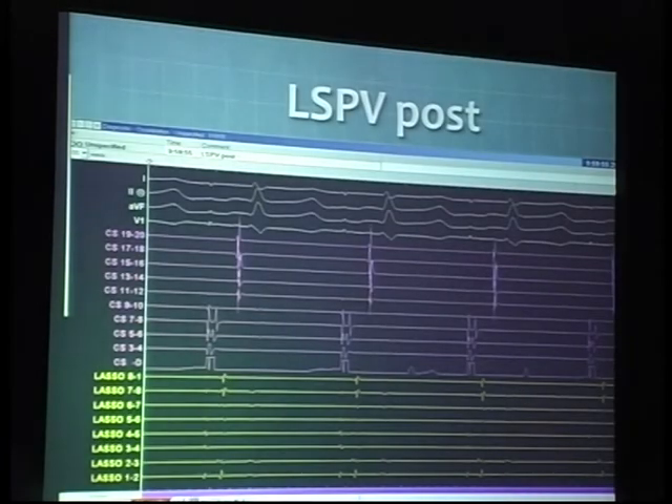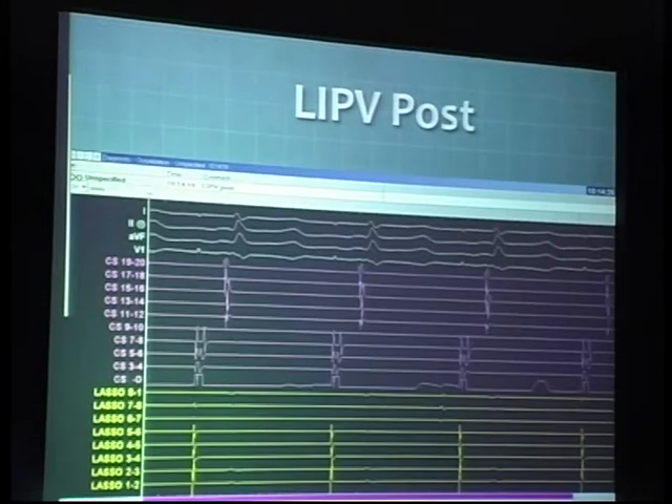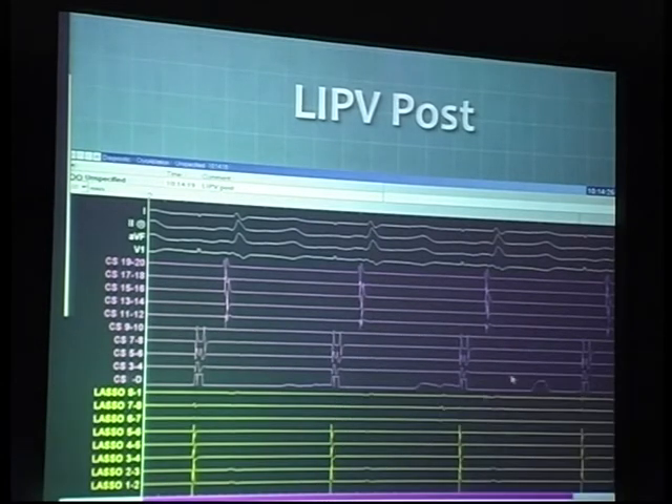This is the left superior pulmonary vein post-ablation. As you see it here, the double potential that was seen earlier is actually gone. This is the concept of differential pacing to basically confirm the presence of the far-field potential from the left atrial appendage that you've been seeing in the left superior pulmonary vein. This is the LIPV post-ablation — you don't really see much of any atrial signal there.